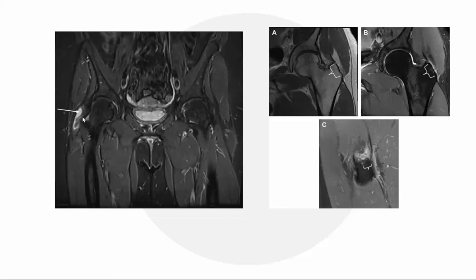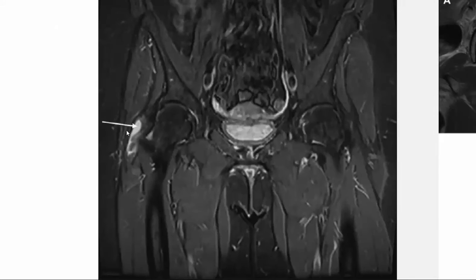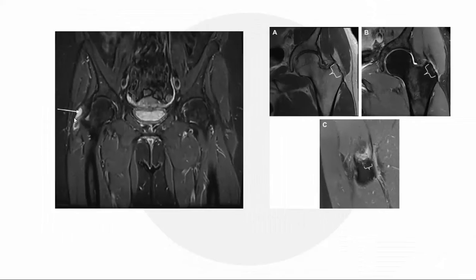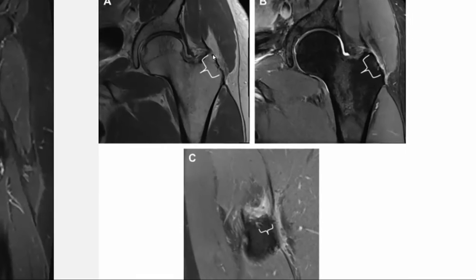So here's the bursa. This is the coronal image of both hips now, so the whole pelvis. You can see femoral head, fat suppressed, fluid sensitive, and this is the greater trochanteric bursa here. It's the peritrochanteric bursa. It's fluid filled, and the actual tendon itself is inflamed. This is long-standing peritrochanteric bursitis with tendon inflammation leading to tendon weakness, scarring, and tearing. So the greater trochanter is bare because the tendon is basically degenerated and torn off.